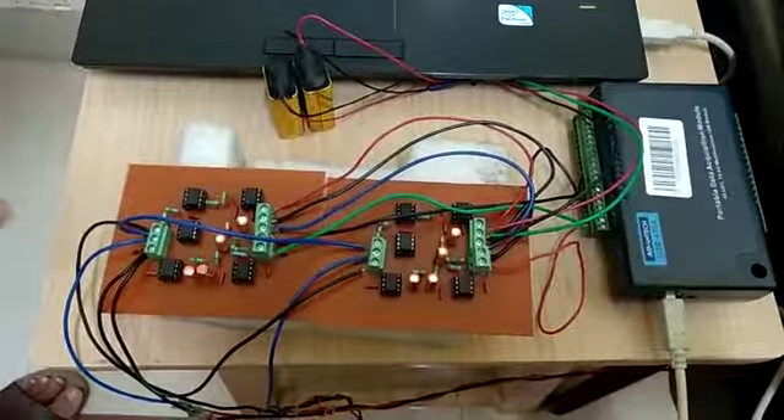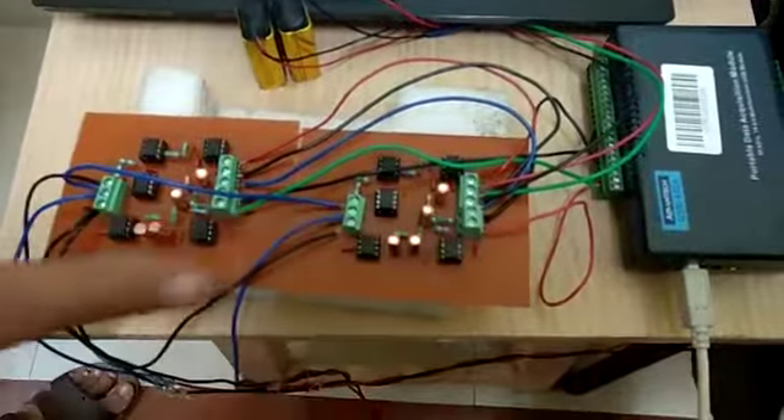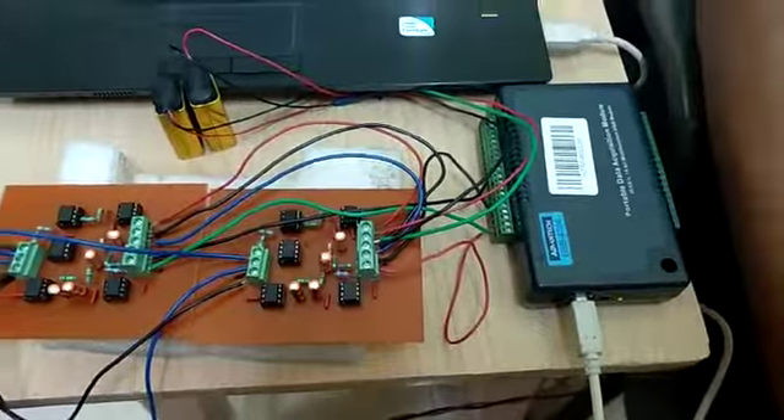This is the dual-channel ECG signal acquisition system developed in our lab. Here are the two bi-potential amplifiers, the battery power supply, and the data acquisition system.